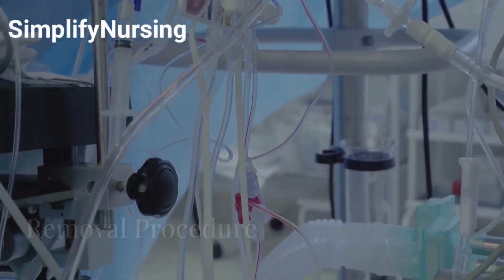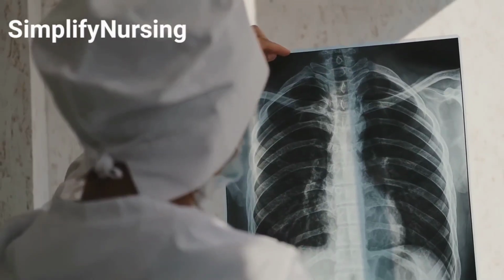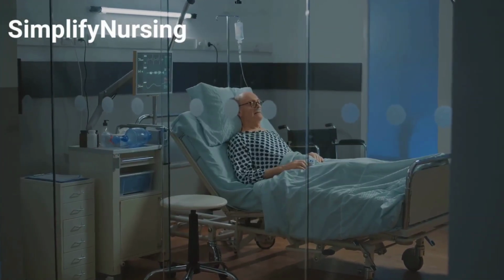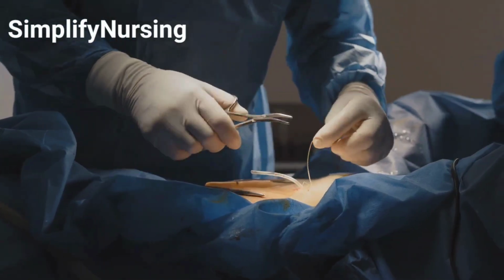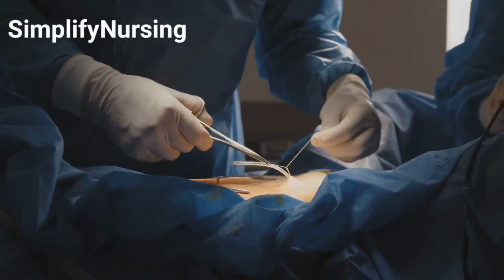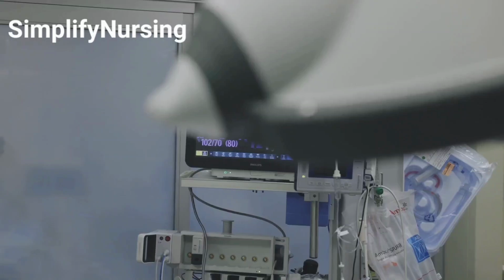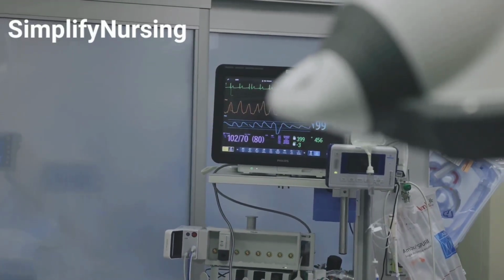The removal procedure involves several steps. First, gather supplies including a dressing, suture removal kit, and sterile gloves. Explain the procedure to the patient and place them in a comfortable position. Next, remove the sutures and gently withdraw the tube while having the patient perform the Valsalva maneuver, holding their breath. Apply an occlusive dressing over the insertion site. Finally, monitor for respiratory distress or complications post-removal.